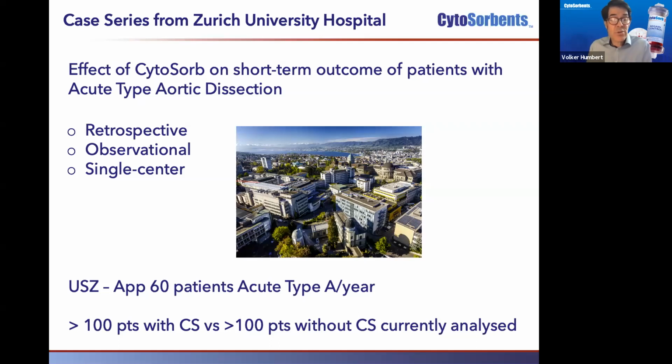And the plan is to compare around 100 patients with intraoperative use of Cytosorb therapy and 100 patients without Cytosorb therapy. So these are some brief words on surgical complexity, or specifically on aortic dissection, as a very promising field of indication for Cytosorb therapy.